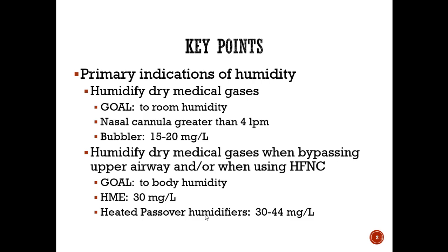We care about the humidity being there when you're talking about those high flows or bypassing the upper airway, because if you're sending dry medical gas into the lungs and creating a large body humidity deficit, we get concerned about the damage that's going to do to your lungs. And we talked about that a lot in the previous lecture.